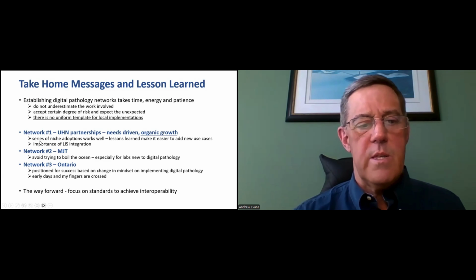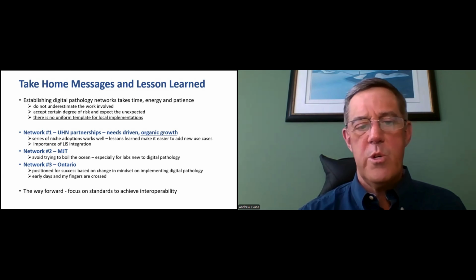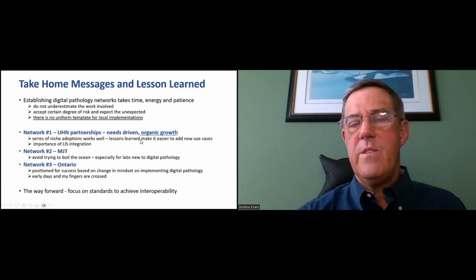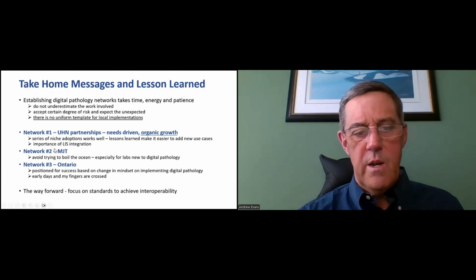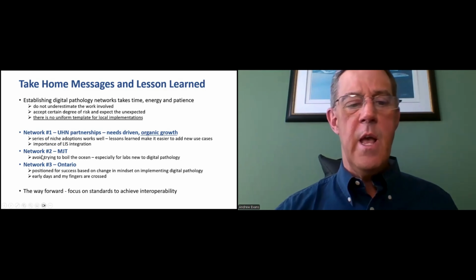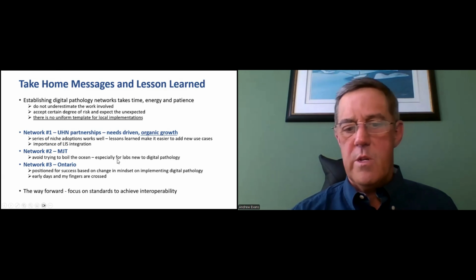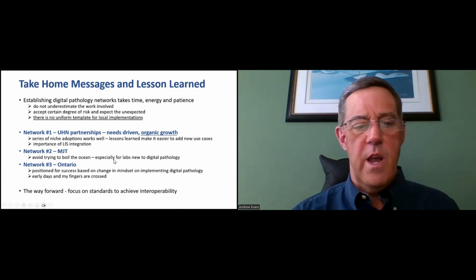In terms of the network projects that I mentioned, Network One, the UHN partnerships, I think that illustrated the importance of taking a needs-driven organic growth approach. So starting with a series of niche adoptions does work well. You can start by learning lessons with easy, very focused applications, and it makes it easier to add on new use cases. These partnerships also illustrated the importance of LIS integration. For the MJT, my bottom line take-home message is avoid trying to boil the ocean, especially when you're working with groups where there's a disparity in digital pathology experience across the group. Expectations need to be managed very carefully there in terms of implementation timelines and goals.